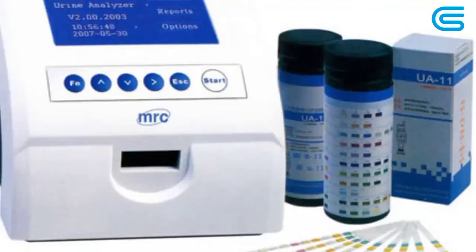Another disadvantage is that it provides limited information about the urine, since it is a qualitative test and not a quantitative test. For example, it doesn't give you precise measurements of the abnormality. Yes, it can give you a range, but it is not very precise. It doesn't tell you the exact abnormality.